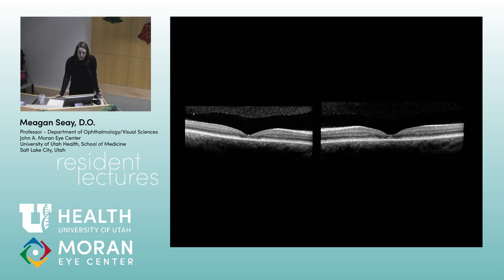And then someone described this macula OCT. Seems to be ISOS loss centrally in both eyes, so like atrophy. Otherwise, looks good. Which again correlates with her visual field, correlates with what she's telling you. So she got sent to retina, and she had an ERG, which was actually normal.